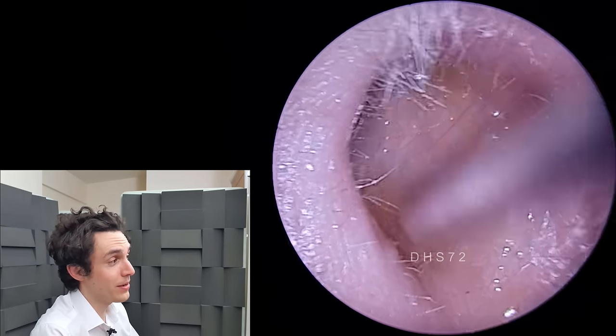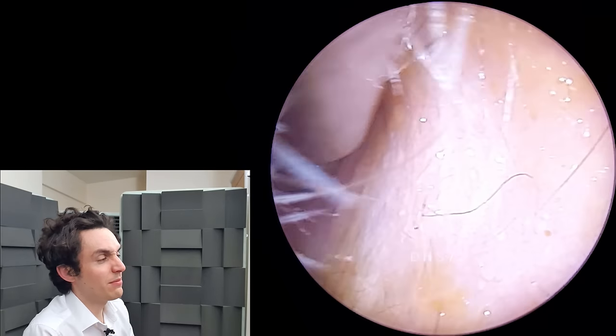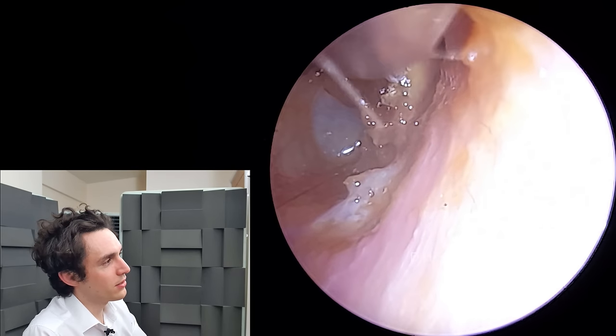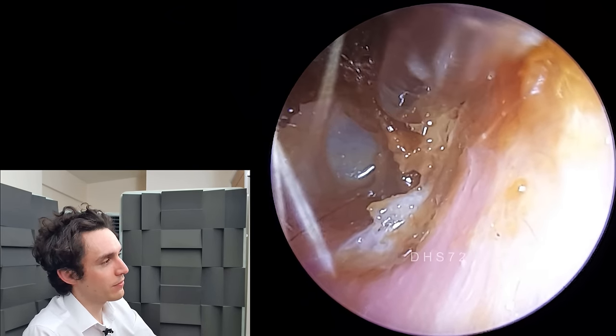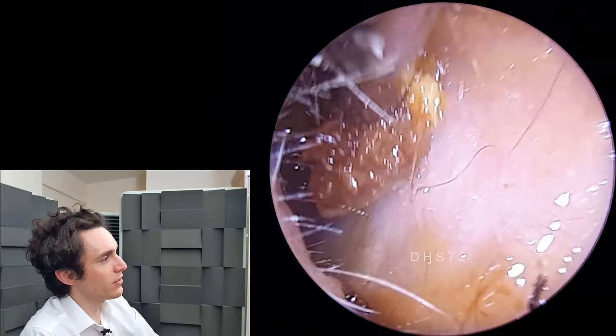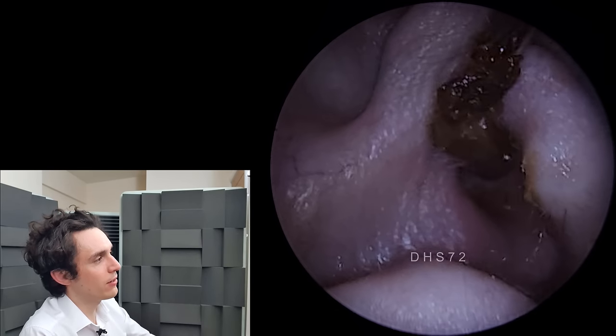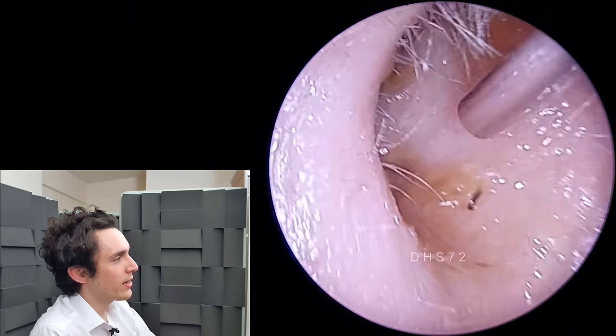It's all sculpted like a piece of art by this cotton bud. So we're just going to have to use a few tricks to loosen this kind of crest wave earwax out of the ear. And here comes the first bit — this is the long tail that was kind of smeared along the ear canal.